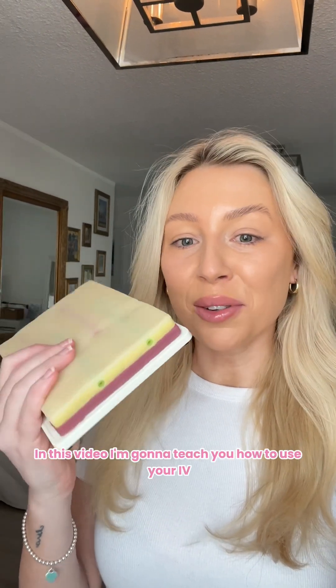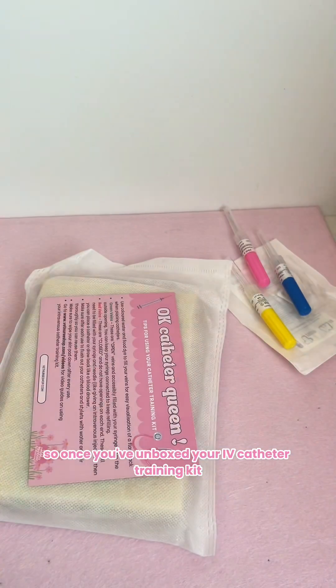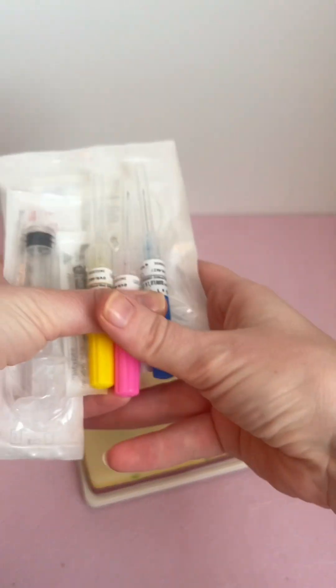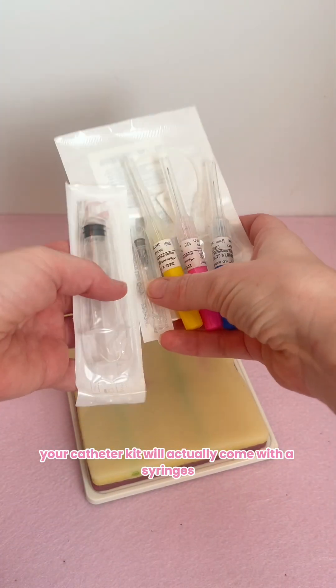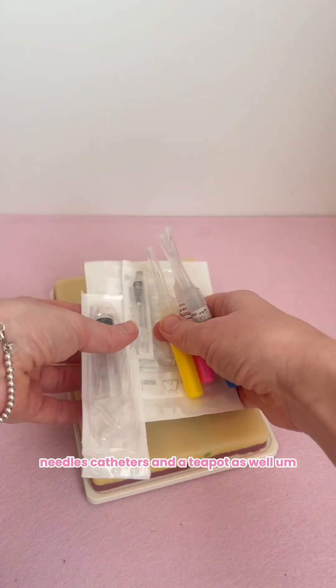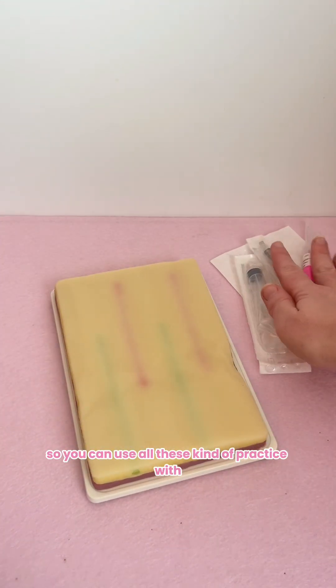In this video I'm going to teach you how to use your IV catheter training kit. Once you've unboxed your IV catheter training kit, it will come with syringes, needles, catheters, and a tourniquet as well. You can use all of these to practice with.